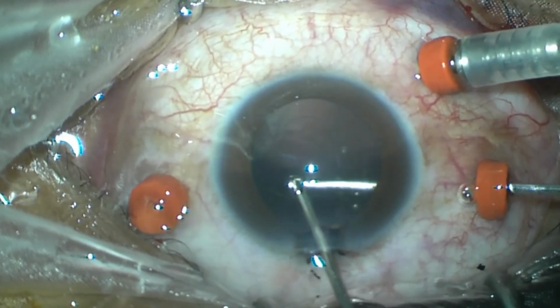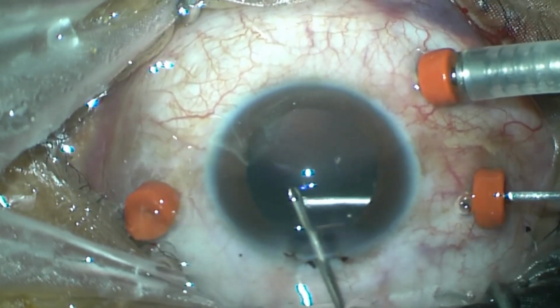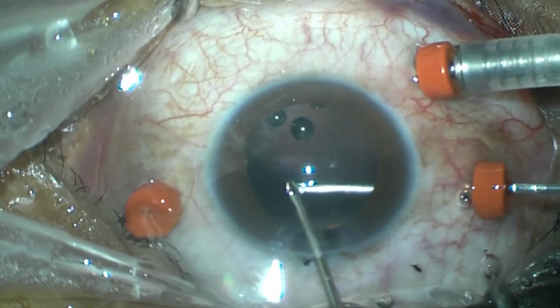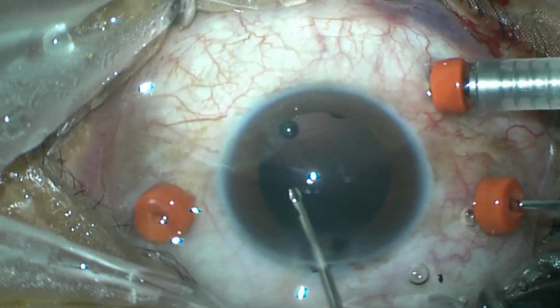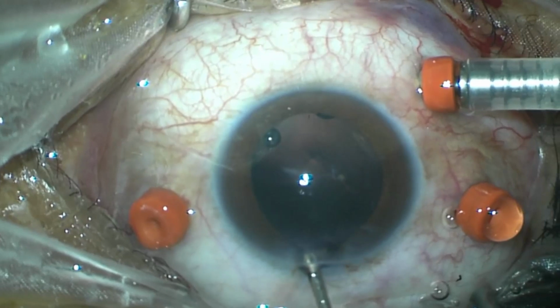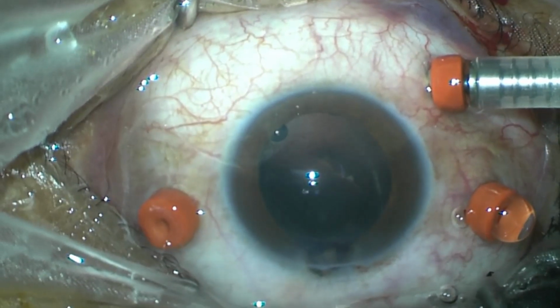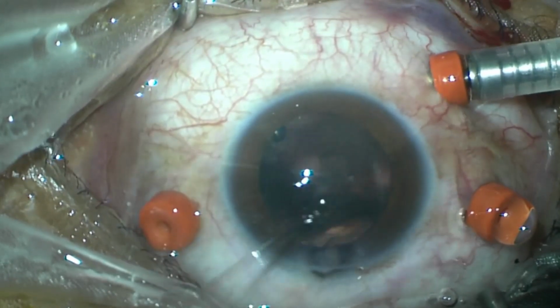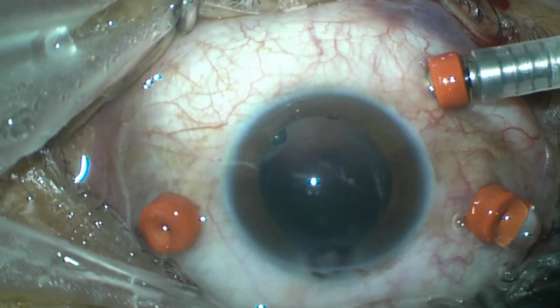Some vitreous fibers which are entangled at this moment can be simply trimmed away using the same cutter which was till now holding the foreign body. We can also clear some vitreous and also some part of the capsule so as to ease the removal of this foreign body through the opening created by the cutter. The foreign body has been pulled out.